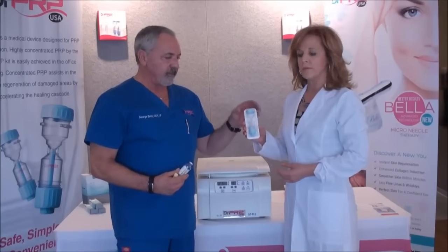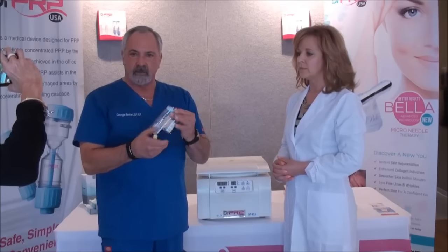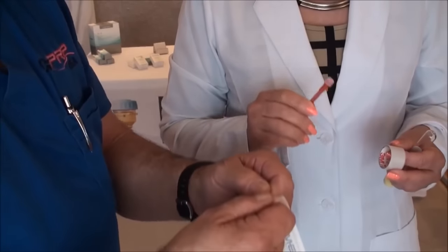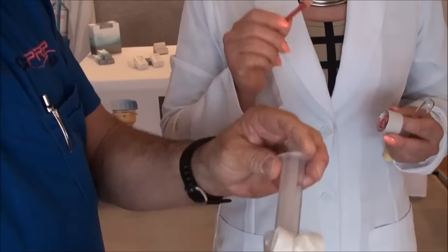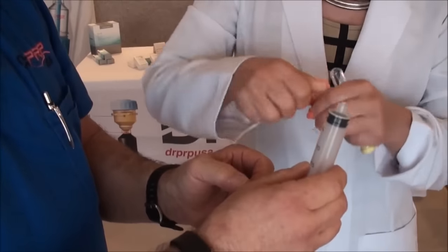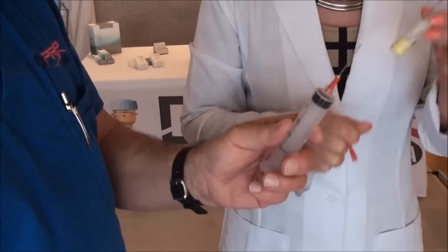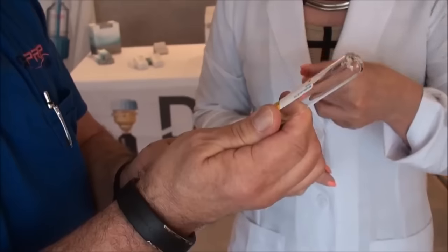Besides the accessory kit, we have the Dr. PRP kit that comes with either an ACD, either in a 30 or 2½ cc ACD. The first thing that you're going to want to do is draw 2½ to 3 cc's of ACD-A anticoagulant into your 20cc syringe. So you'll attach the needle and draw the ACD, the anticoagulant, into the syringe.